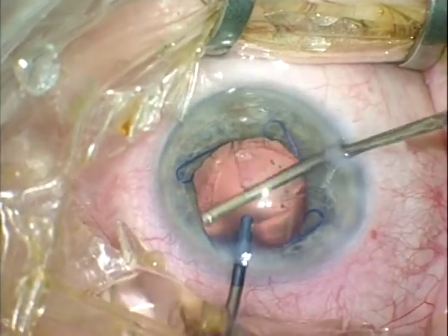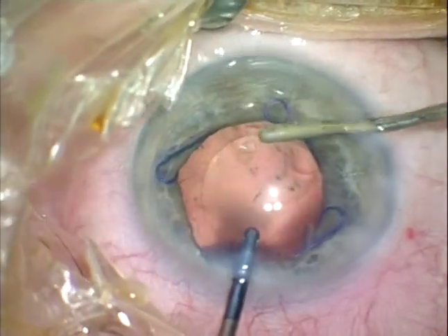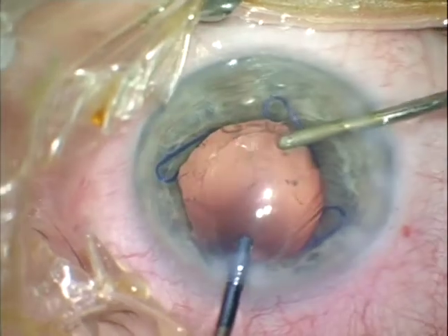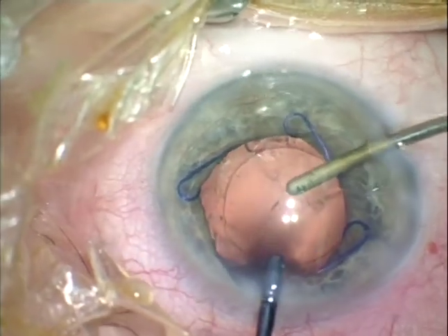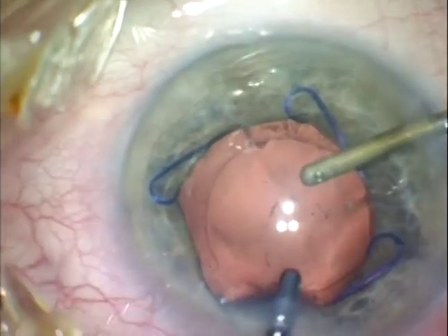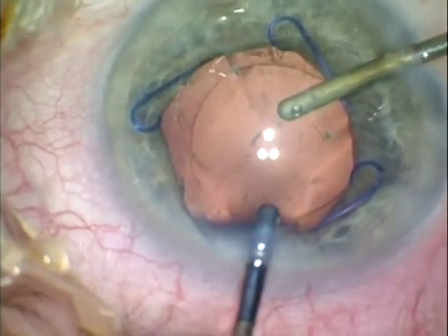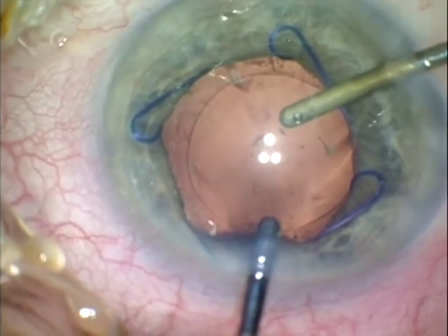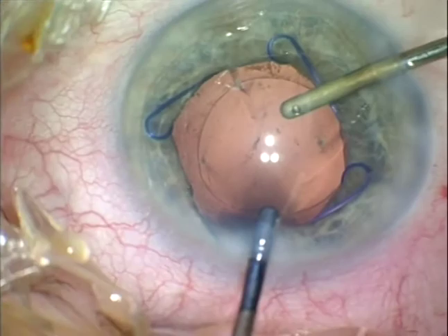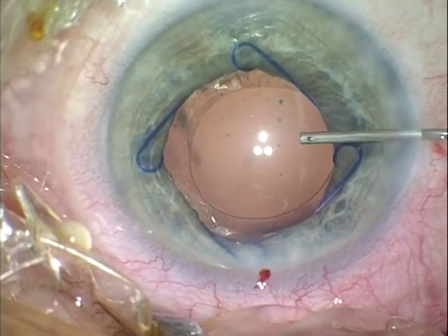Final steps of cortex evacuation and capsule polishing are now being done, and we can see here that the capsular bag is slightly mobile. Specifically, the posterior capsule is mobile, representing weakness of the zonular apparatus of the eye.